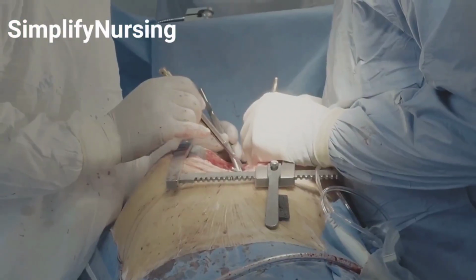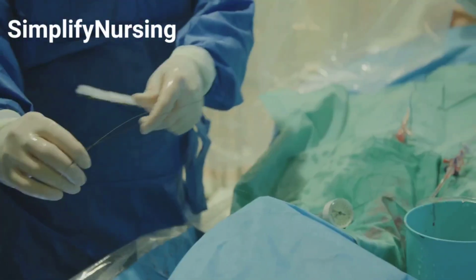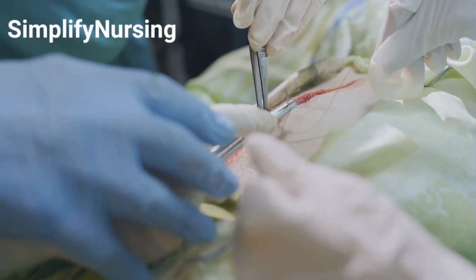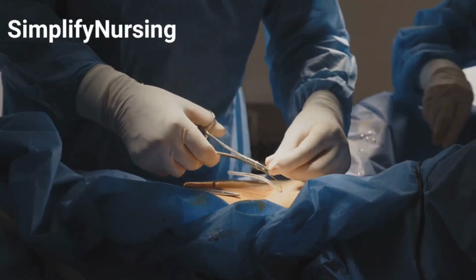Make a small incision in the skin. Insert the chest tube using a blunt dissection method. Advance the tube into the pleural space, ensuring proper placement. Secure the tube by suturing it in place and attaching it to a drainage system. Finally, apply a sterile occlusive dressing around the site.